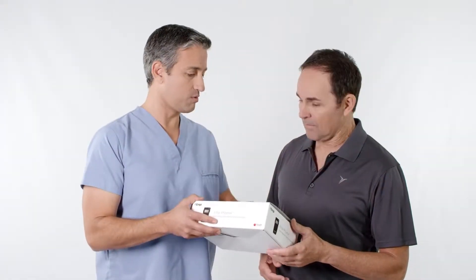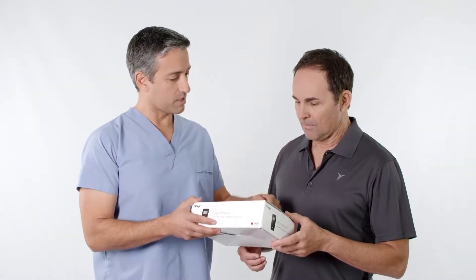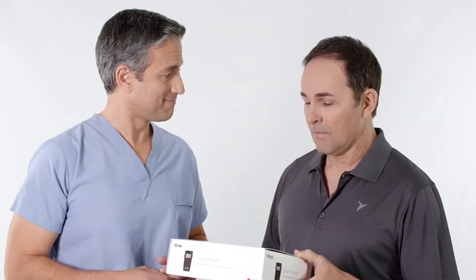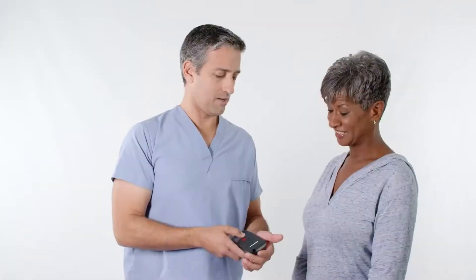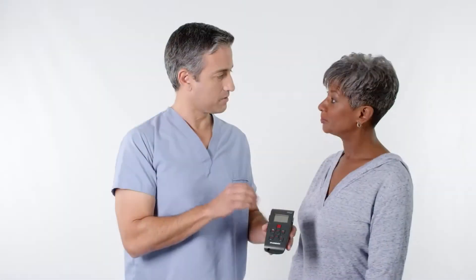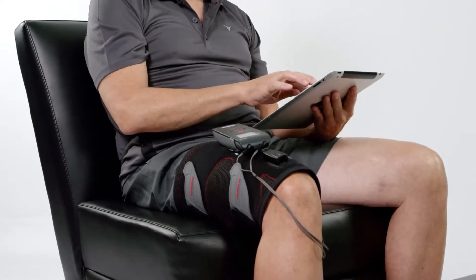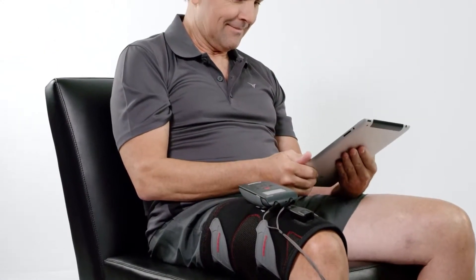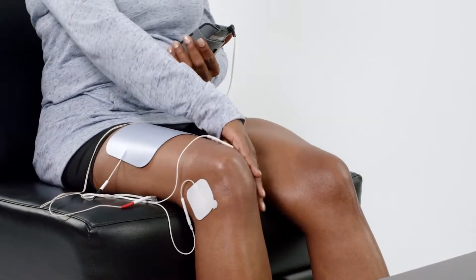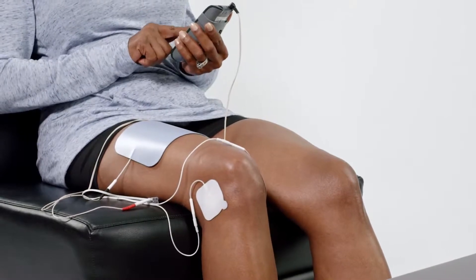Millions of patients around the world have used MP products to help them recover from injury or surgery. Your doctor has prescribed this device to help you improve your recovery. Your clinician may have provided this device to you directly at the clinic, or had the device mailed directly to your home. The MP Phoenix is designed to make your NMES therapy simple and easy. This video will walk you through the basic steps to set up and use your device properly.